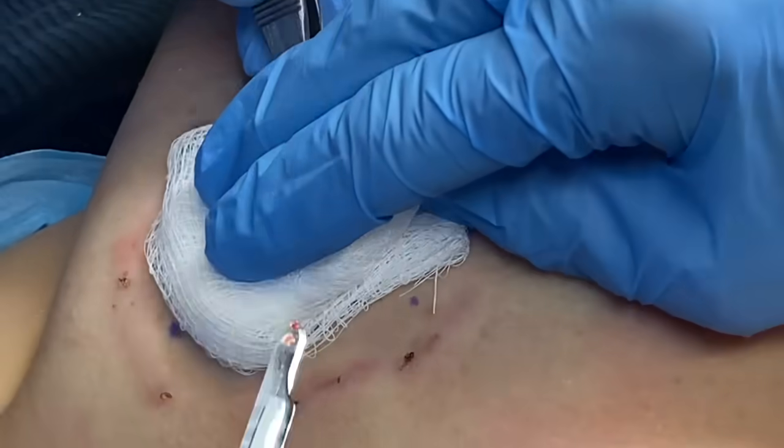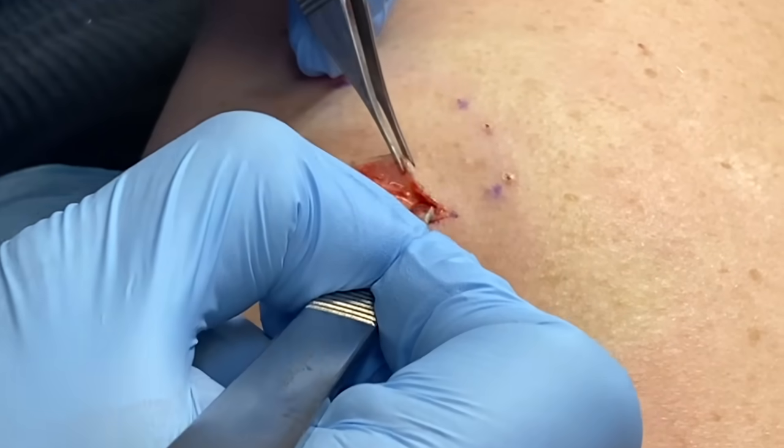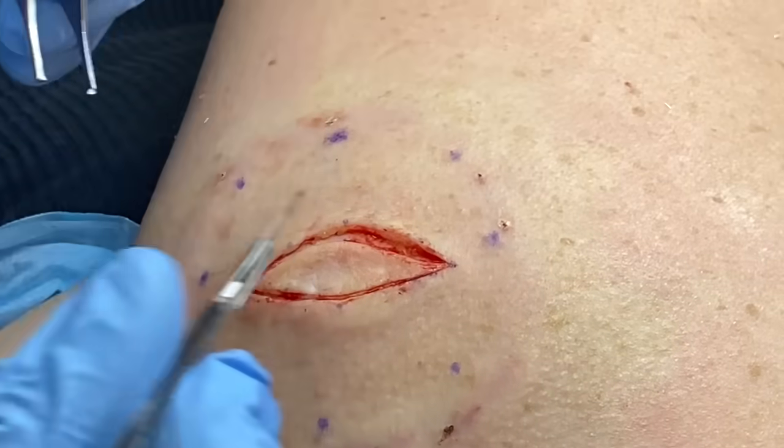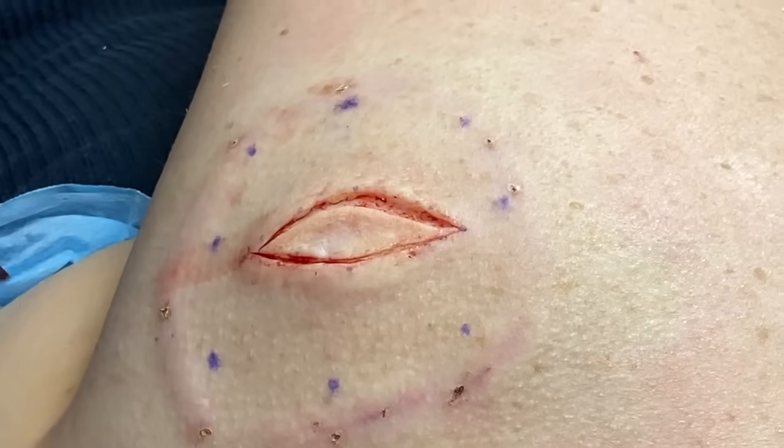You dab that for me, Rada? So this is essentially, I just want to be extending this slowly and consistently. And we'll do the ends last because that should be close, and that's why we always have them close to the margin, so that I can dissect down quicker.